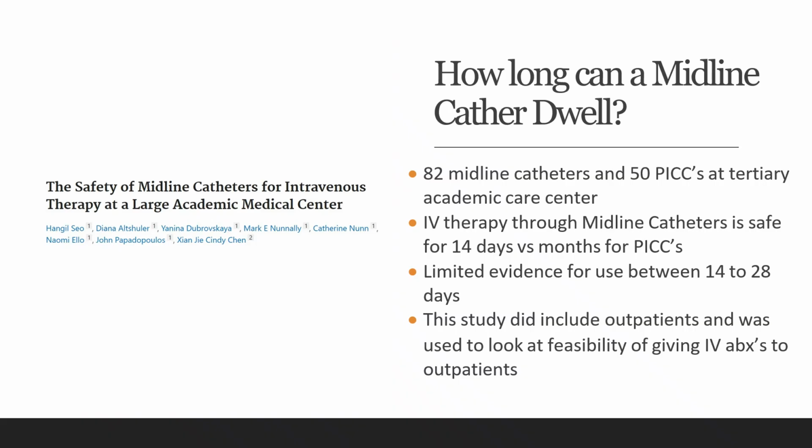So in learning about midline catheters, something that may come up is questions of this product, of just how does it work? How long can we use it for? Is it better than others? So this first study that I found essentially is just looking at how long can a midline catheter stay in that vessel and still be useful.